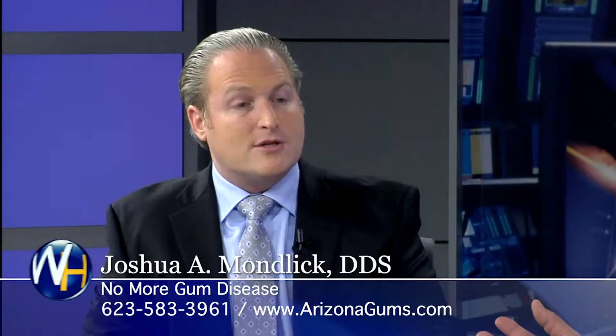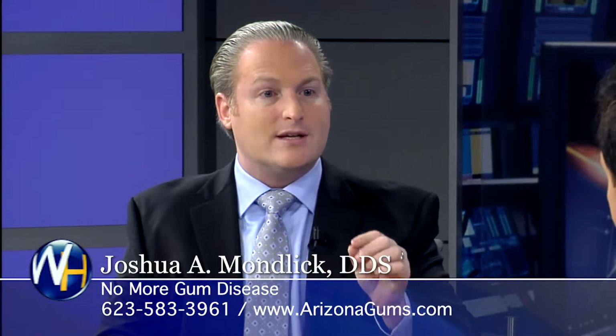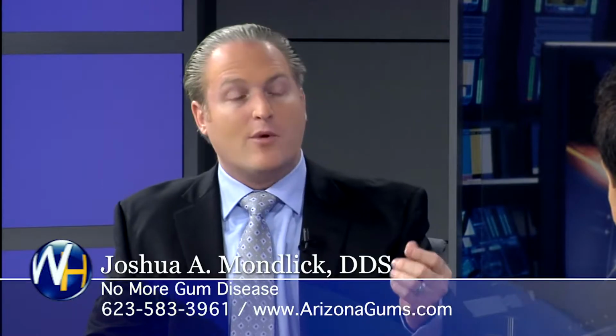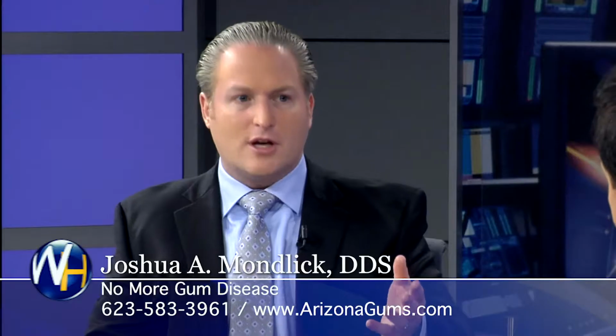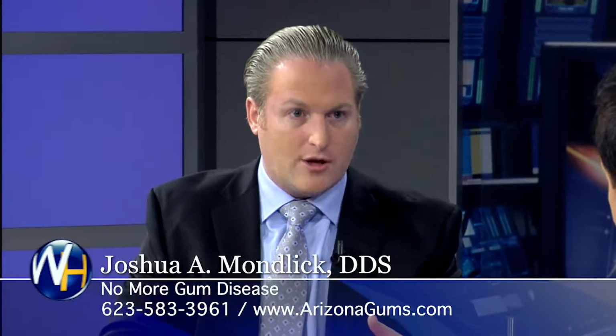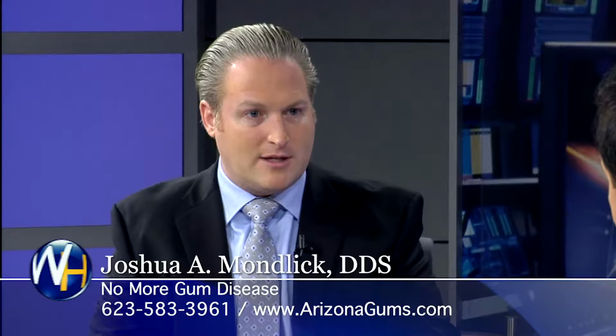So how does the laser kill the bacteria? That's the part I'm not getting. The laser actually is selective. It uses light energy. These bacteria have light characteristics, essentially a color, and they're sensitive to certain colors, and so the laser, because it's very selective, actually selects and kills this bacteria.